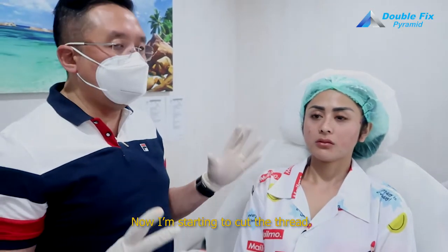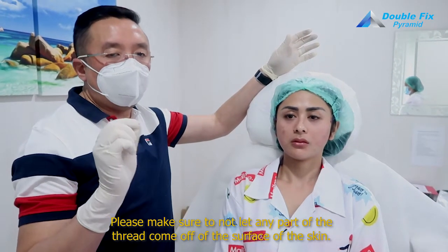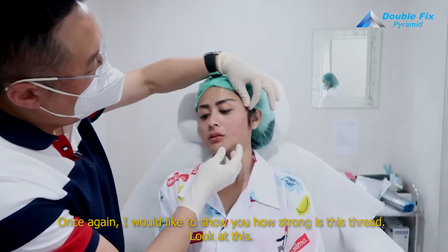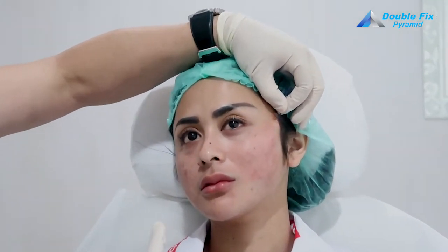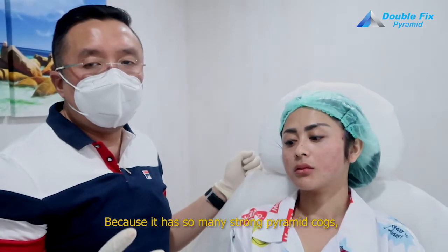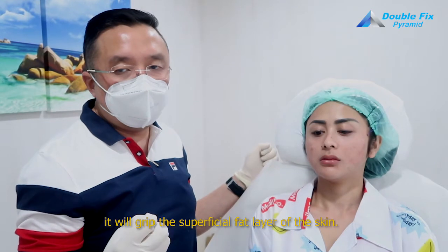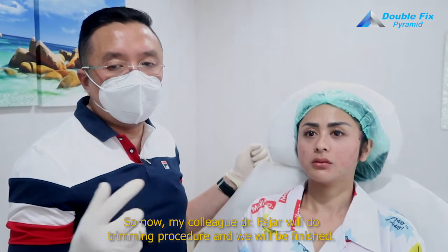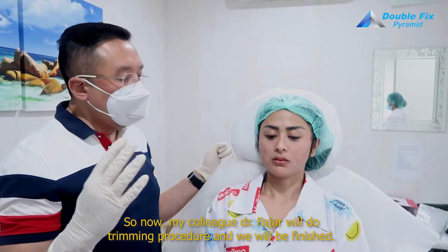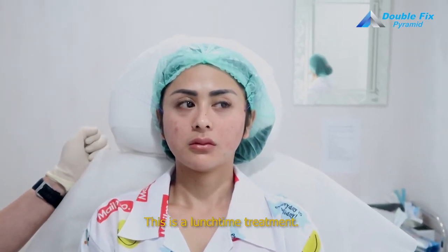Now starting to cut the thread. Please make sure not to let any part of the thread out of the surface of the skin. I would like to show you how strong this thread is — because it has so many strong pyramid barbs, it will grip the superficial fat layers of the skin. Now my colleague Dr. Fajar will do the trimming procedure. You can see there is no dimple on her, no downtime — this is really a lunchtime treatment.